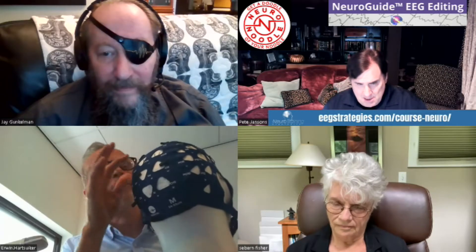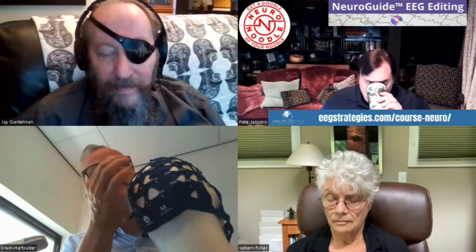This cap here is a new cap we're putting on the market. It uses the shielded cables of the Nexus 10, which go all the way up to the electrodes. They use little silver silver-chloride discs. You put just a drop of gel beneath it, and I can set up a four-channel link to your configuration with this headset in less than 60 seconds.